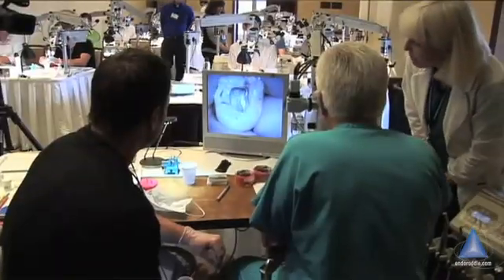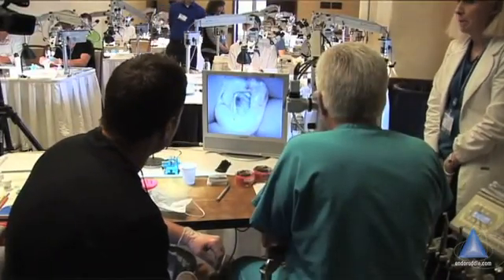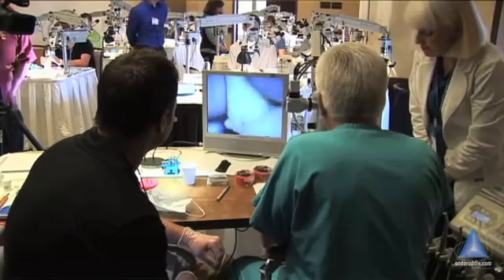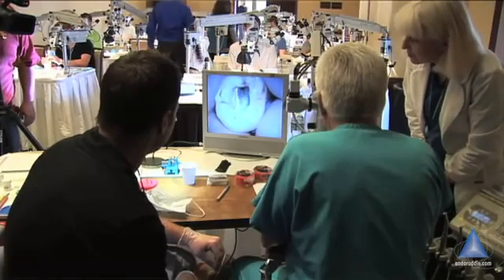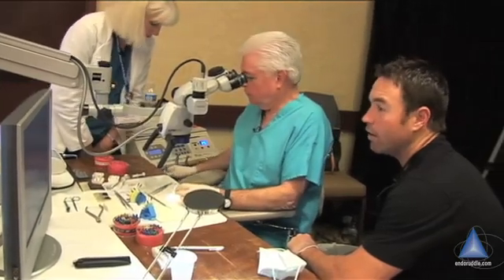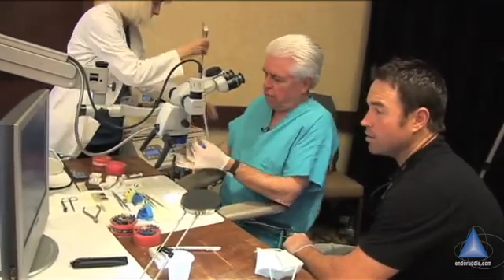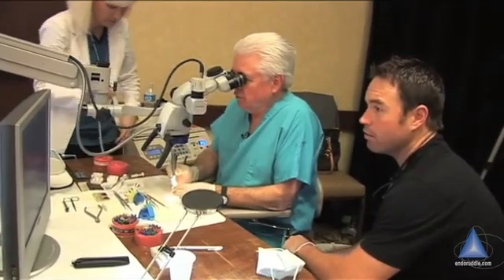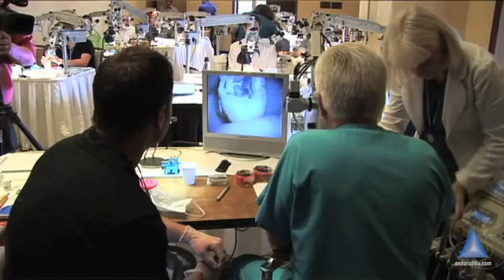This is our access — to see where I was looking. There should be an orifice there, looking at the root. I don't know if I need to chase that. Do you want me to do a little something here? Yeah, I just don't know — I don't have enough experience. Don't worry. Do you mind if I just kind of smooth this up?